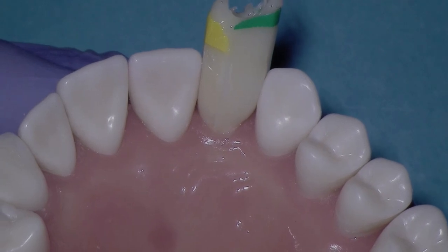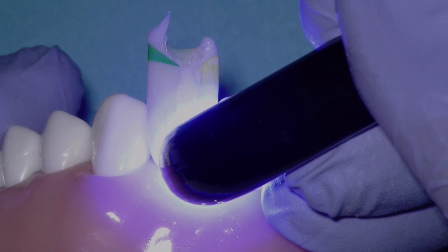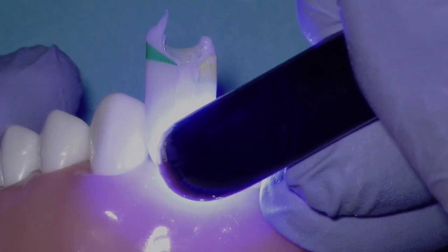Now we're ready to light cure. We'll cure 10 seconds, 10 seconds, 10 seconds, 10 seconds, 10 seconds, and 10 seconds to make sure that we're fully cured.